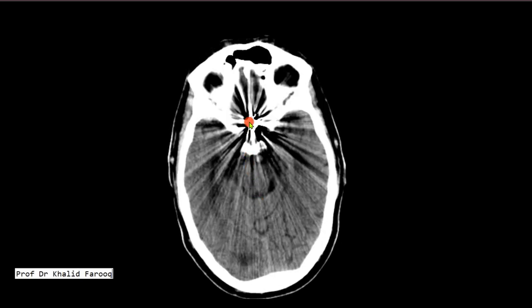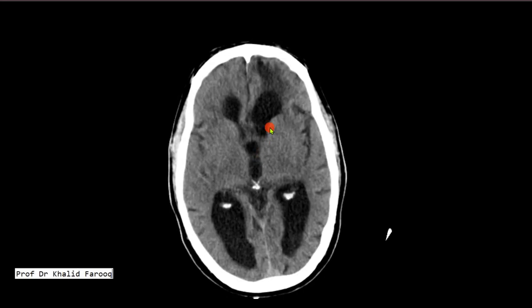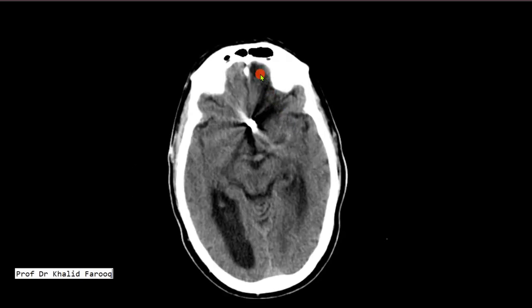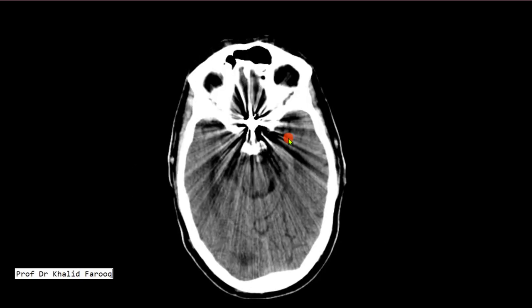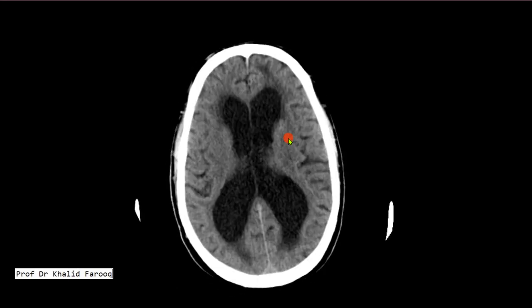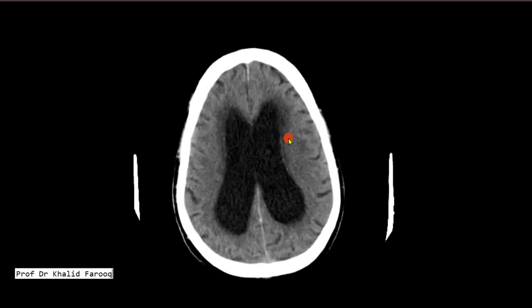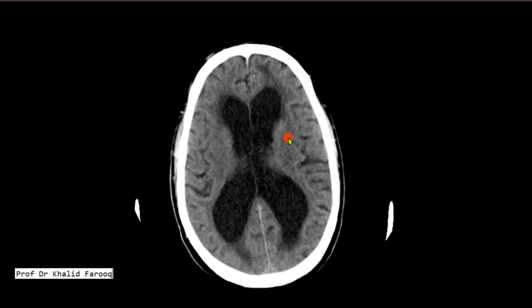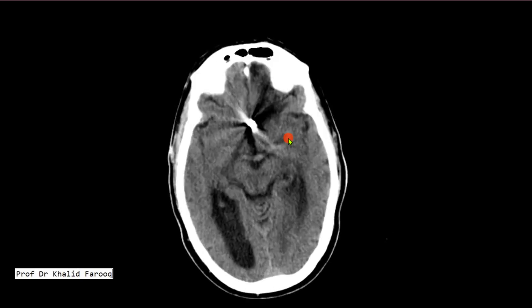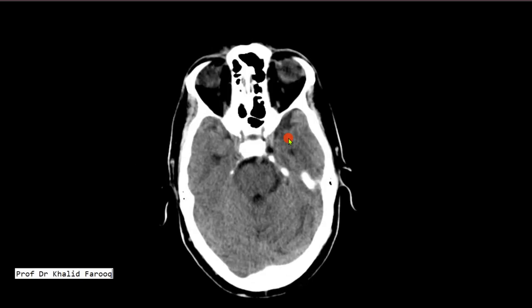There is a metallic artifact because of previous clipping of an ACOM aneurysm, while low-density brain parenchyma is seen along the anterior inferior aspect of the left frontal lobe — possibly the sequelae of previous intervention, favoring gliotic changes.